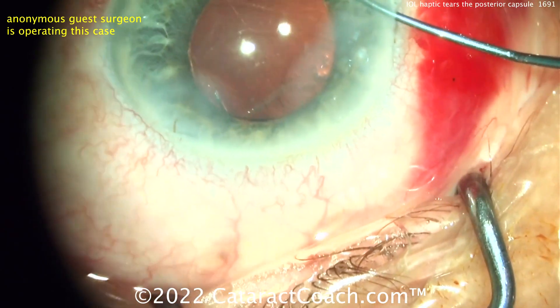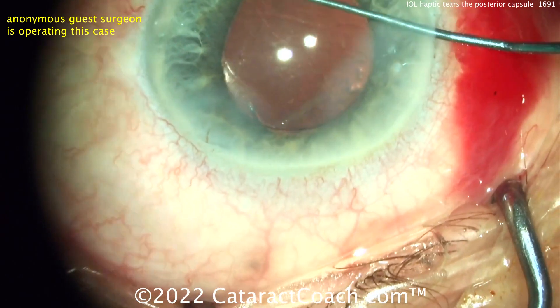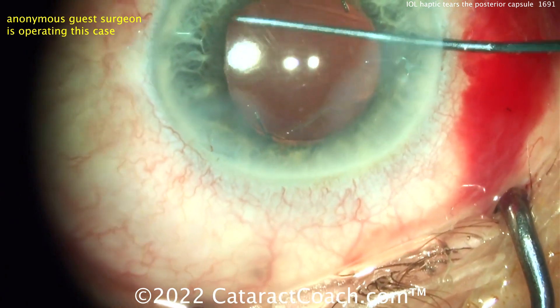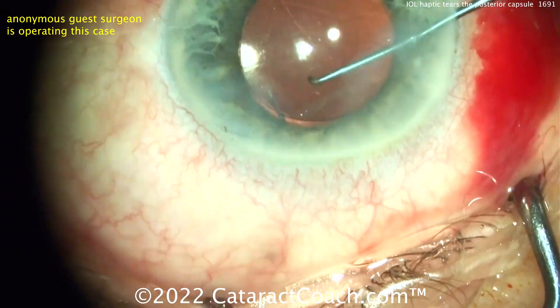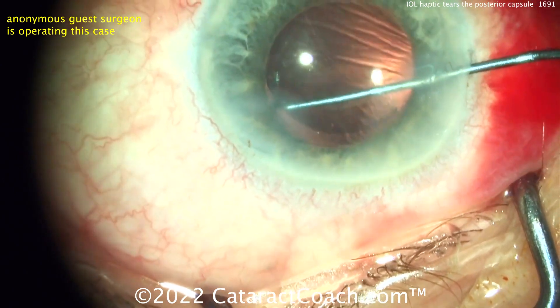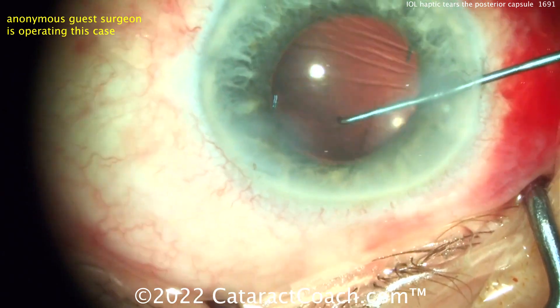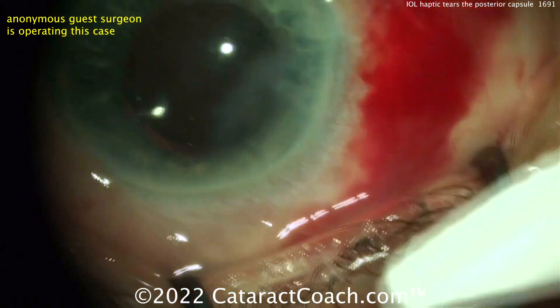At this point you may want to put more viscoelastic in the anterior chamber — that'll give you a lot more working room. The AC won't be as shallow and you won't be as prone to causing further issues. Just looking with the chopper or Sinskey hook, trying to get that trailing haptic dialed in.